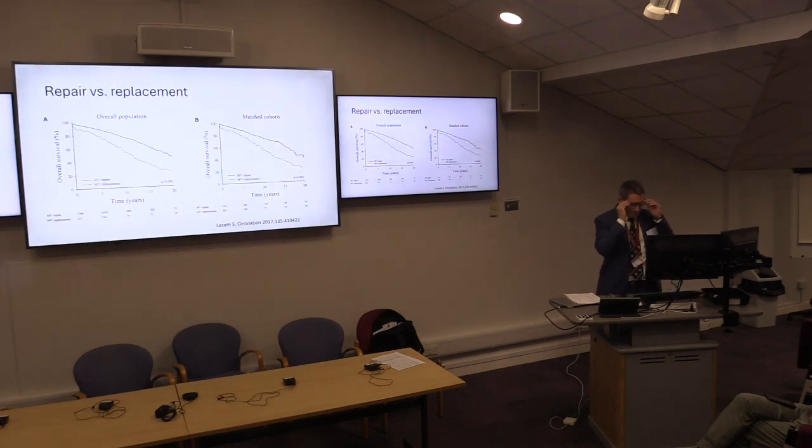So, I pulled out these data because I think this is just worth stressing to a surgical audience. I am a friend, not a foe, and you guys have got 20-year data, so we don't have that in TEER at the moment. And certainly, if you've got evidence of durability. So, looking at this, for me, this is pretty impressive.